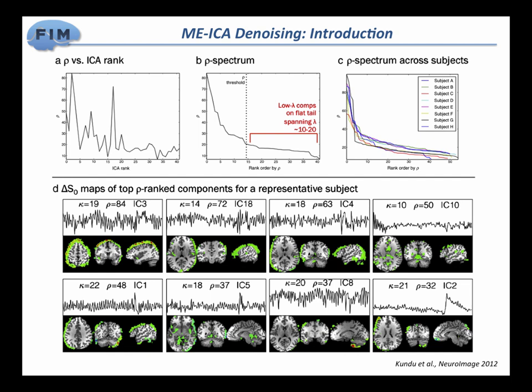I mean, the idea here is you can have single echo data, you can do an ICA, and then have people go through each of the components and decide whether it's noise or not. The idea here is that by having multi-echo, you can do that in an automatic manner. Nothing precludes you from having single echo, doing an ICA, and with your knowledge, deciding what's noise or not. Here, you can automate that.